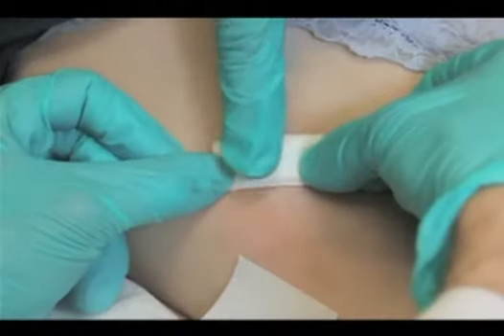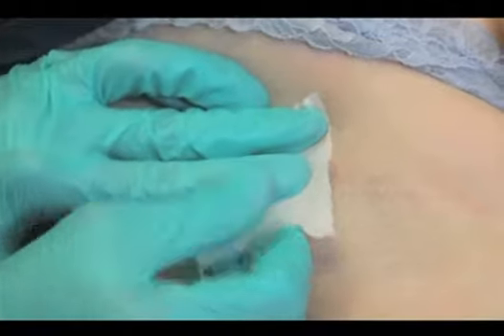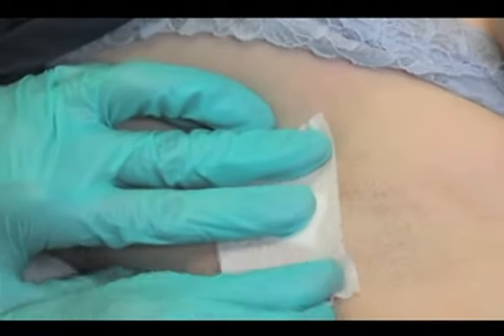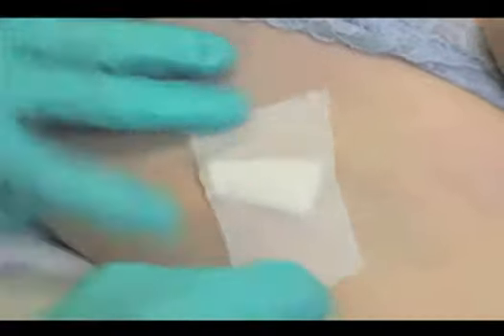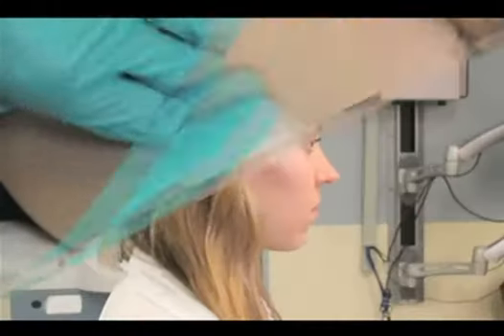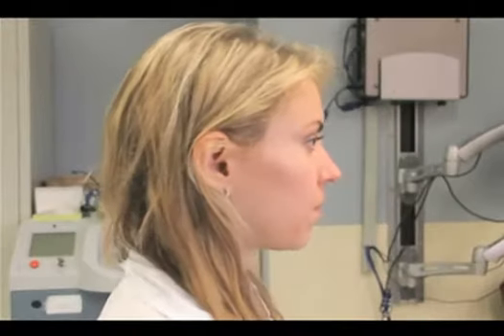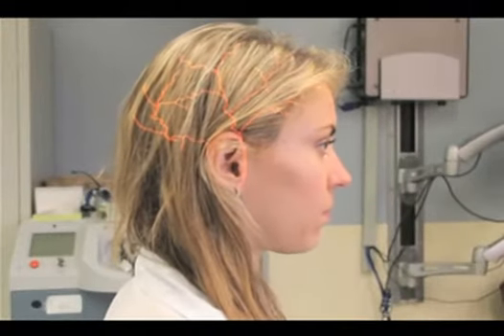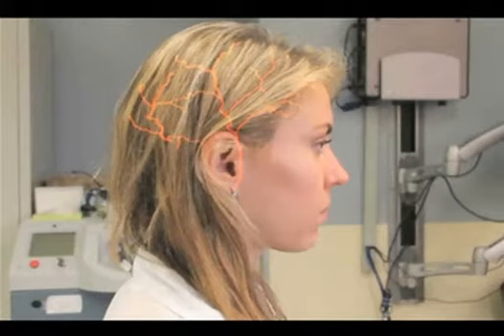In patients with thrombocytopenia or those taking an anticoagulant, it is typical to place a pressure dressing over the sutured site to prevent late-onset bleeding. It can be left on for 24 hours. Remember the anatomy when performing a punch biopsy so that you avoid damage to major blood vessels and nerves. For example, avoid punching medial and lateral digits and palpate for the temporal artery before biopsying near the temple.